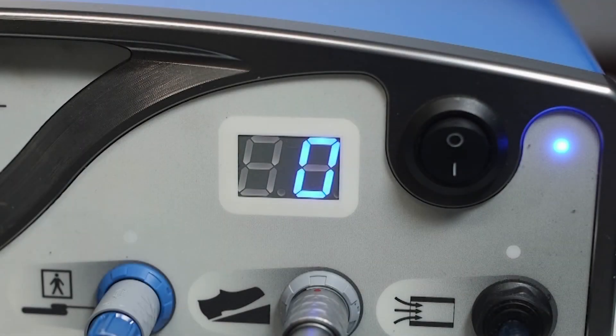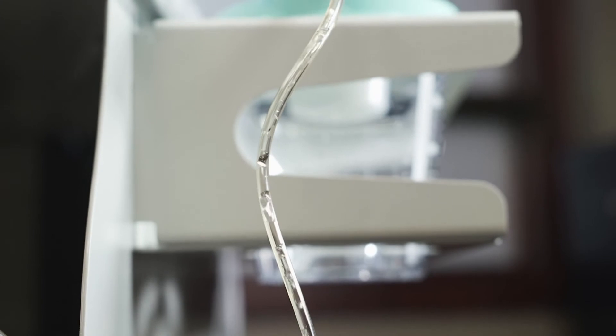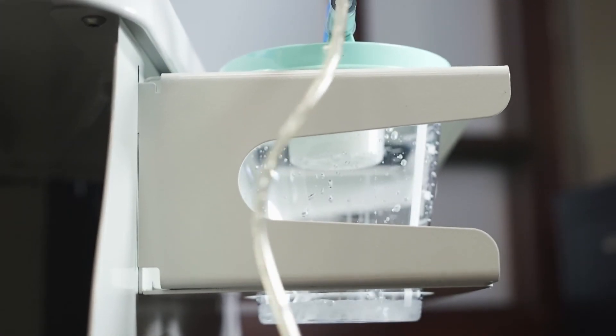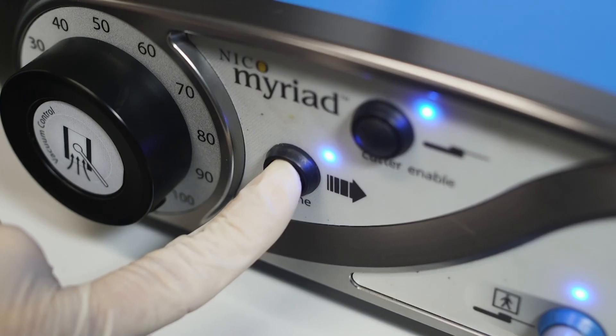Before using the system, it is required that the handpiece be primed by aspirating fluid into the aperture through the handpiece and tubing and into the canister. This can be accomplished by pressing the prime button while aspirating sterile fluid from a small bowl or bulb syringe.